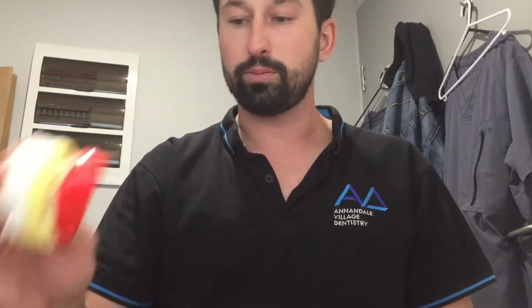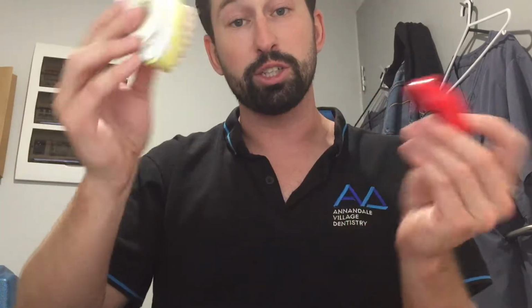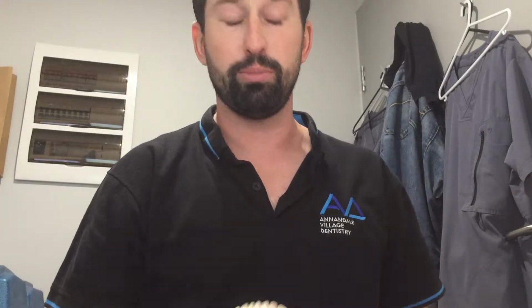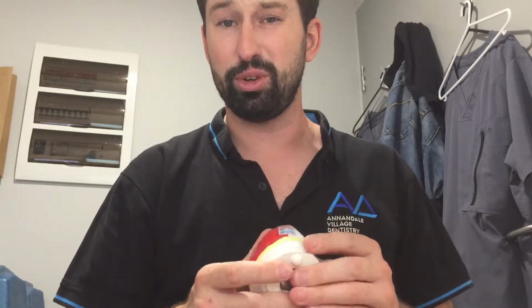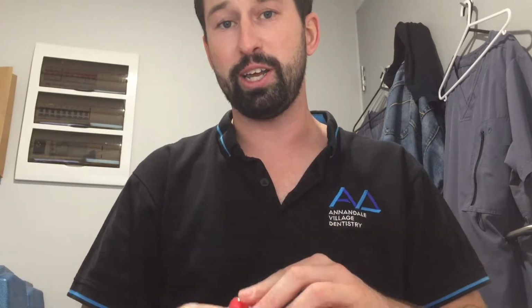So, what happens if I do want it to come out? Well, with a boil and bite, I don't need to do much. It falls out on its own. In fact, I actively have to be thinking about keeping it in place. And you may be worried, well, the custom mouthguard, that looks like it fits in really well. Is it even going to come out if I try to get it out?